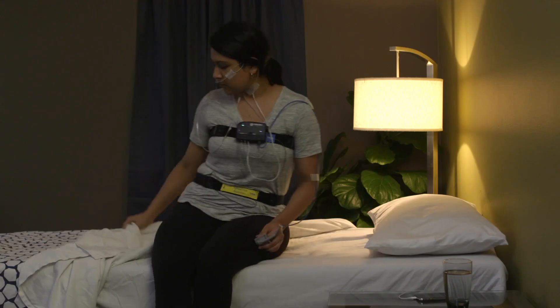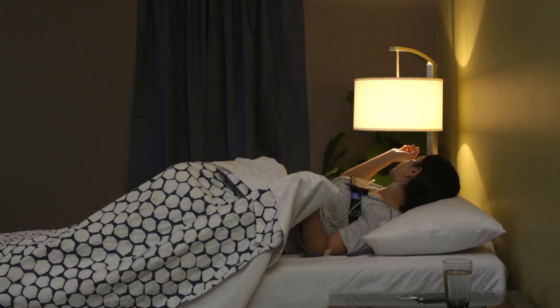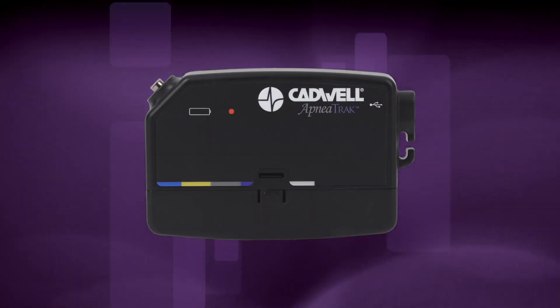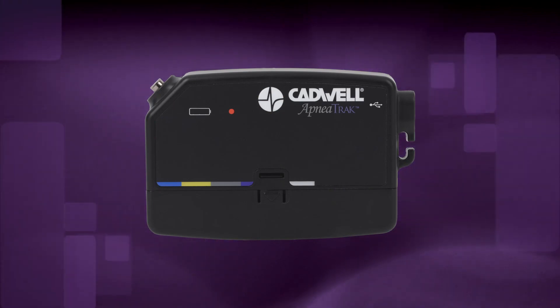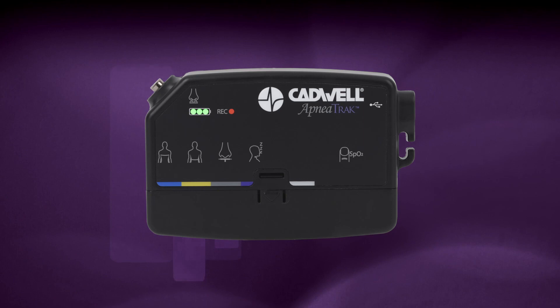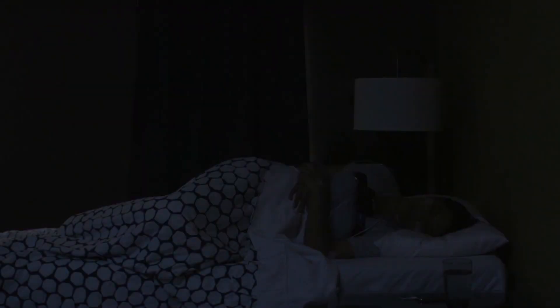If any cable disconnects, simply plug it back in and the recording will continue. To record an event for review, press the raised Cadwell logo event button once to mark an event in your sleep study data. Write down the time and the reason of the event for your physician to review. To check if the device is recording at any time, push the event button and the recording LED will illuminate for a few seconds. If you feel uncomfortable, you can move the apnea track to either side of your chest, but please leave it on the front of your body to correctly record your body position during sleep.